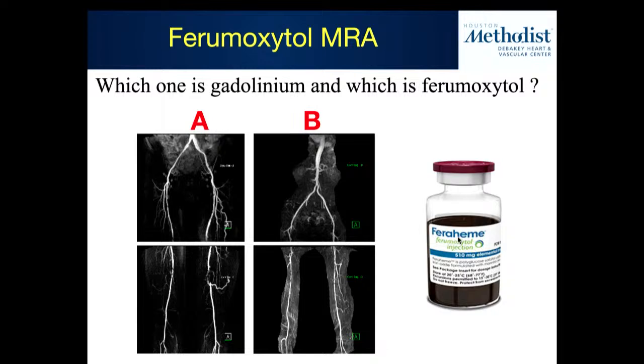Can anybody tell me which is which? How many think this is gadolinium? Raise your hand. Okay. How many think this one is gadolinium? Raise your hand. So we've only got 3 or 4. Most people are abstaining. But it's equally split for the ones that do vote. In fact, this one here is with ferumoxytol. This one here is with gadolinium. Right? You can't really tell the difference.